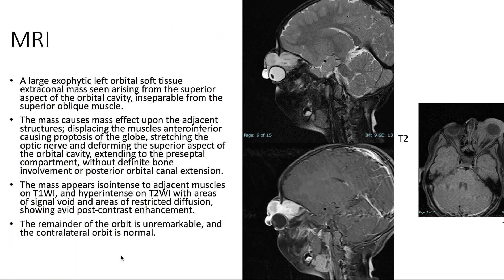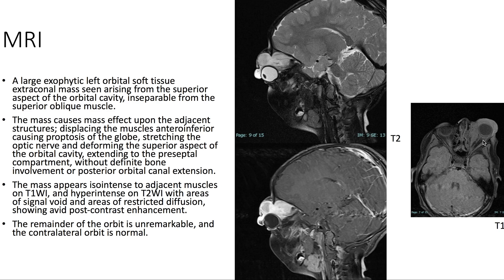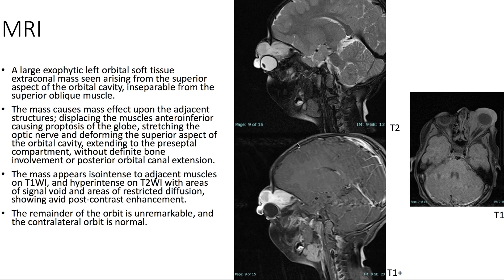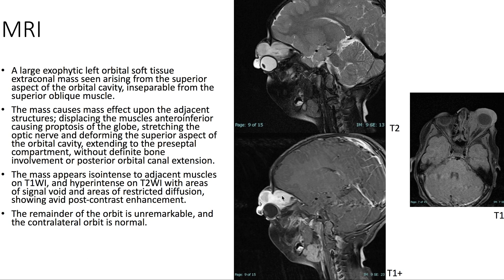On MRI, we see a large exophytic left orbital soft tissue extraconal mass arising from the superior aspect of the orbital cavity. The lesion is seen to cause mass effects on adjacent structures. On T1, it is iso-intense to adjacent muscles. On T2, it is hyper-intense, and on T1 with contrast, we see avid post-contrast enhancement.